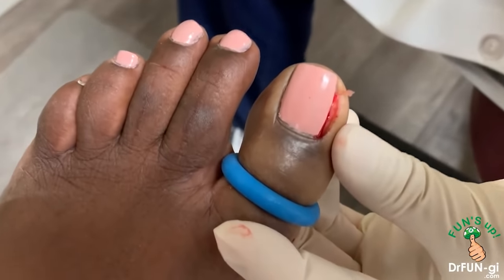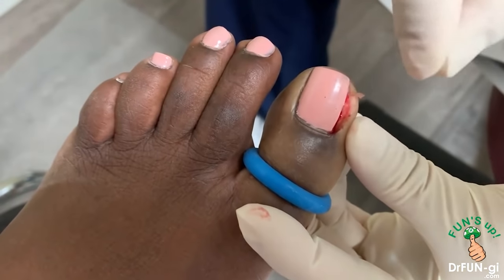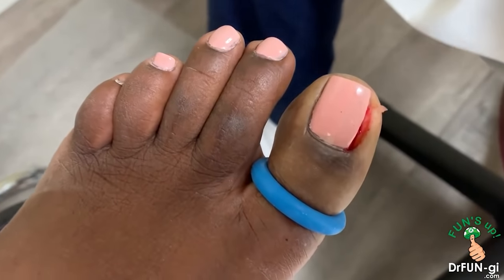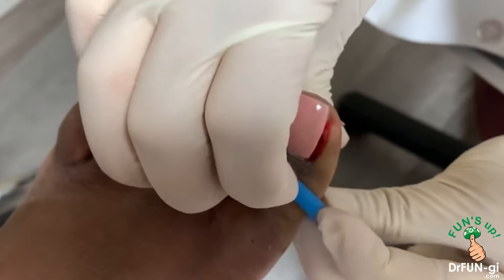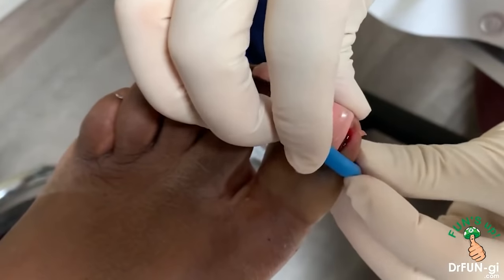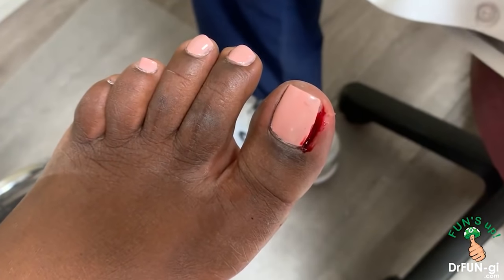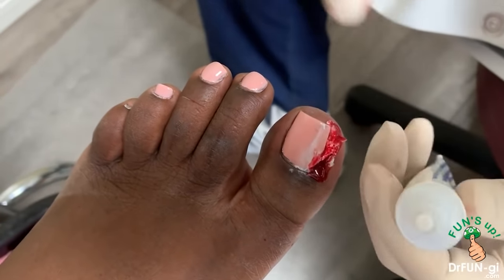What caused this problem? The nail salon — they were working on it. It was ingrown a little bit, and they probably dug a little too much at the nail salon, so that's what might have caused the problem. I'm turning the tourniquet off now so blood is coming, so I'll be quick and make sure the area is covered up.